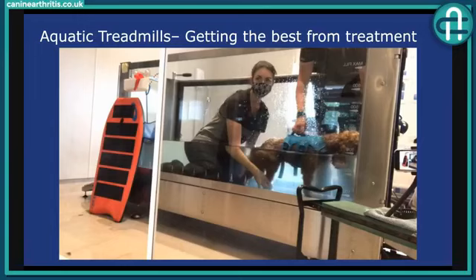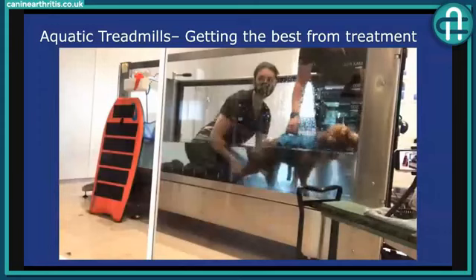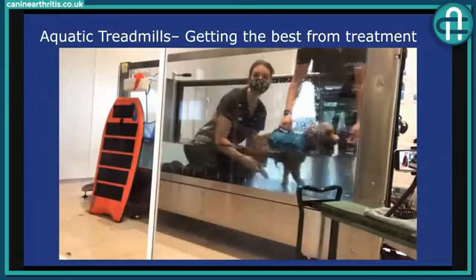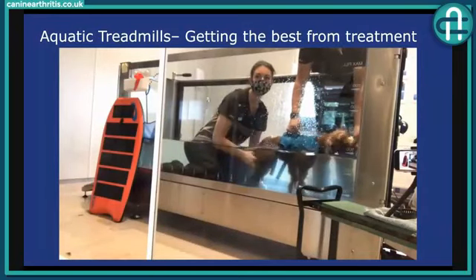Absolutely. And we'll talk about the importance of the treat being placed at a certain height as well. So if you as a pet owner are taking your patient for hydrotherapy or in an underwater treadmill, you may be asked to help at some point. And how you help handle your pet will make a huge difference to the success of the treatment as well.